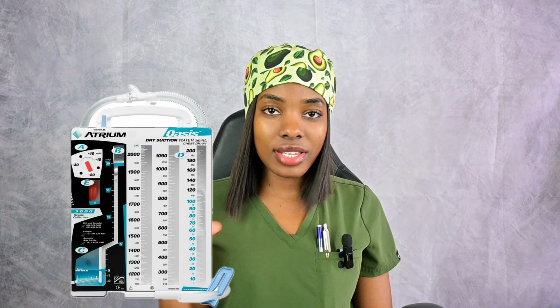On today's video, we're going straight to talking about chest tubes. What are chest tubes? A chest tube is a hollow plastic tube that goes in between your ribs to remove air, blood, or fluid from the pleural space, and that is the space around your lung.